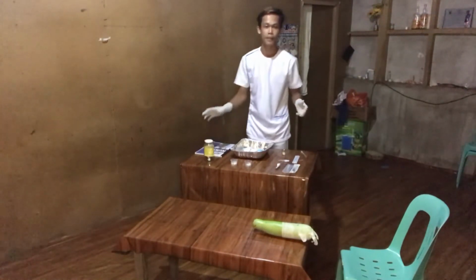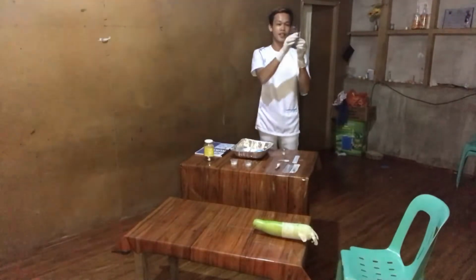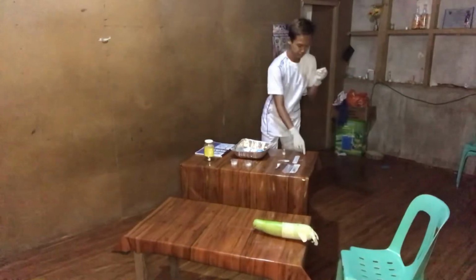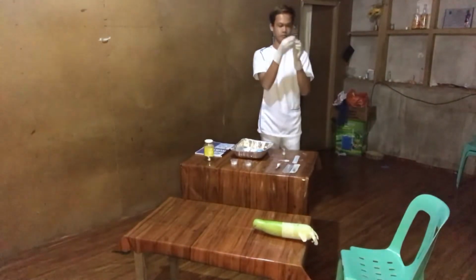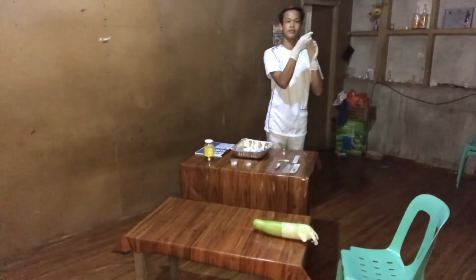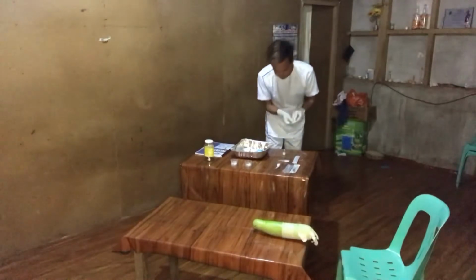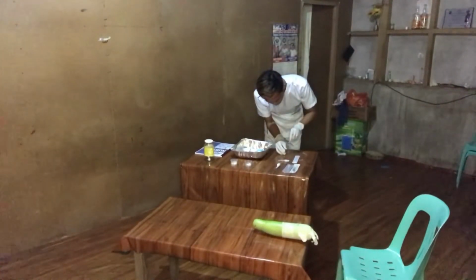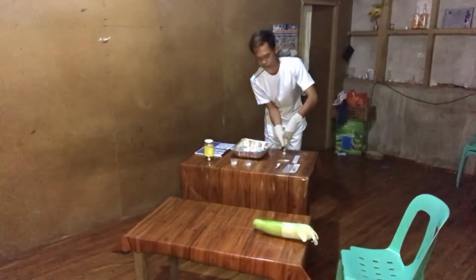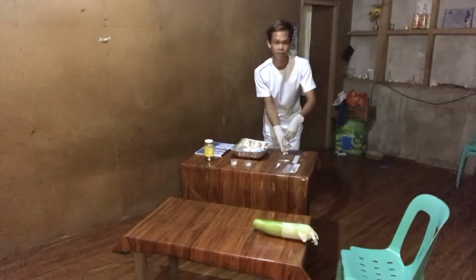Now take the syringe, pull the plunger and draw some air inside the syringe. After that, inject the air into the vial, then invert the vial and draw the exact amount of medication needed.